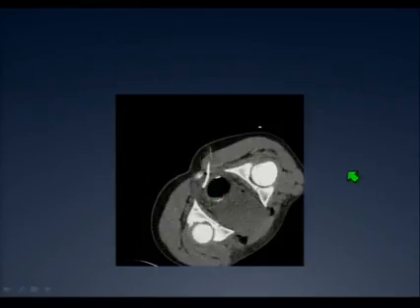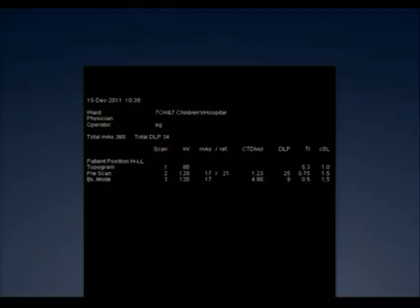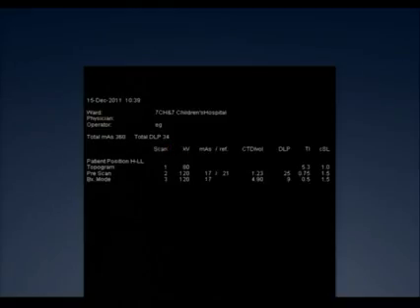Now remember, we used almost 200. 200 was the dose-length product for that. 34. Now, before I got interested in this, maybe 5 years ago, they would have used diagnostic level mAs to do that, and the dose would have been quite high.